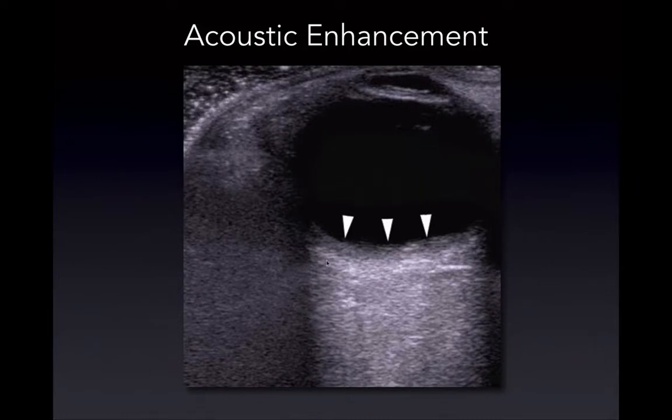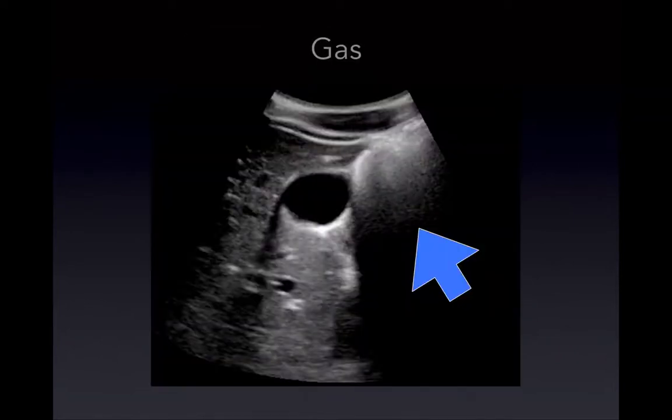We have to keep in mind that when we're measuring, for example, the gallbladder, if we were to measure the posterior portion of the gallbladder, we would have a false positive. We would think it's enlarged, but it's not. It's because of that artifact.